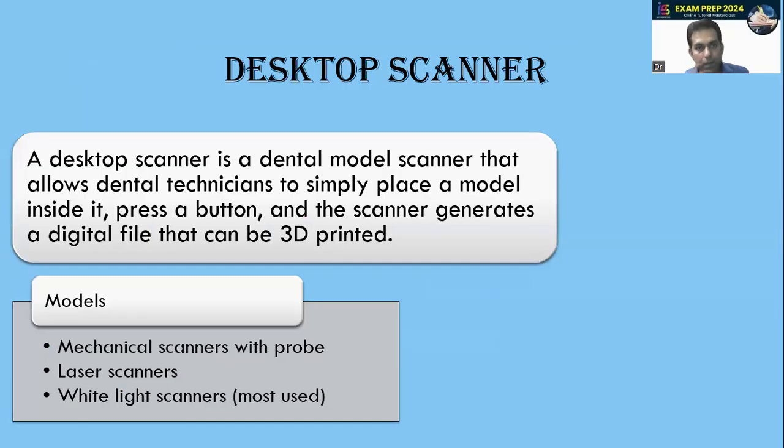Now, regarding the desktop scanner, a desktop scanner is a dental model scanner that allows dental technicians to simply place a model inside it, press a button, and the scanner generates a digital file that can be 3D printed.